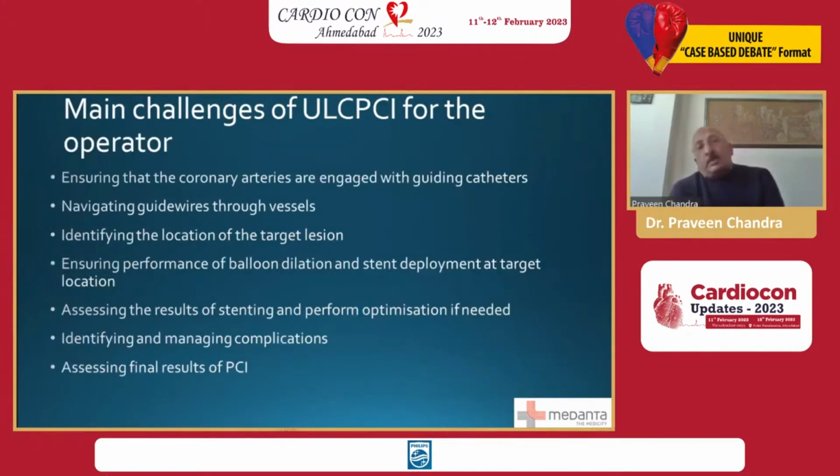So, as you already understand, the challenge of ultra-low contrast PCI for the operator is that he has to engage the guiding catheter and know when the guiding catheter is engaged, because our habit is to engage the guiding catheter and give contrast. We don't do that anymore. We now understand how to navigate the guide wires through vessels without putting contrast in, identify and locate the target lesion with the help of IVUS and FFR, and ensure pre-dilatation balloon and stent deployment at the target location, again with the help of imaging and FFR.